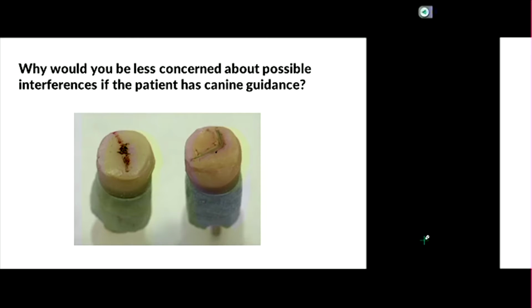But if you want to overcompensate, because remember, the more steep your inclination is, what do we say about the amount of space in the posterior? You have more or less? More, right? And then the more shallow it is, you have less space, right? So let's say your patient is average, 30, okay? And then you set on your articulator, we said, okay, it's better to set it more shallow. We overcompensate. We'll say it's 0, okay?